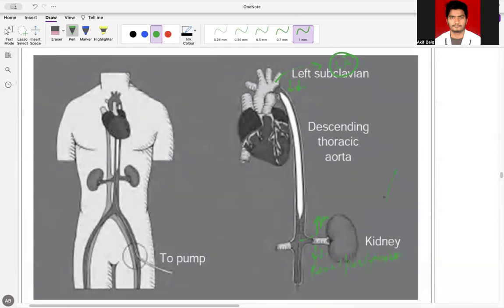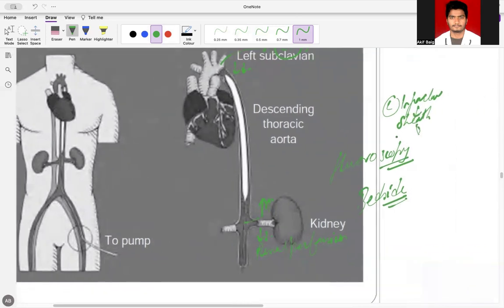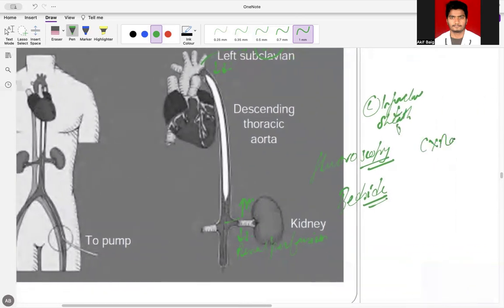That's why we usually use fluoroscopy to check that. Also, it can be done at the bedside if fluoroscopy is not available. You can measure the distance from the left infraclavicular space up to the sheath, and then place the balloon accordingly, and then follow up with a chest X-ray.